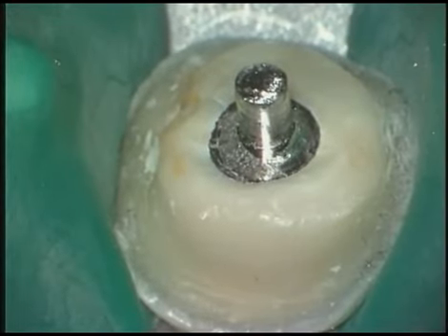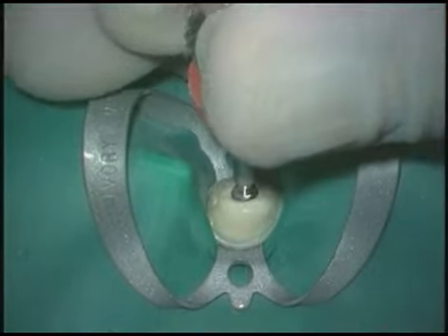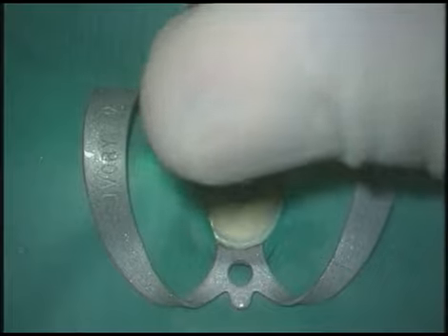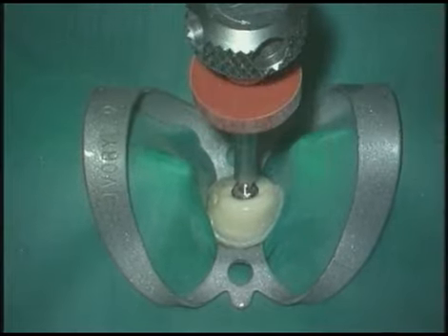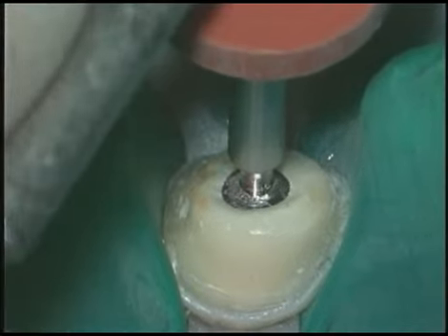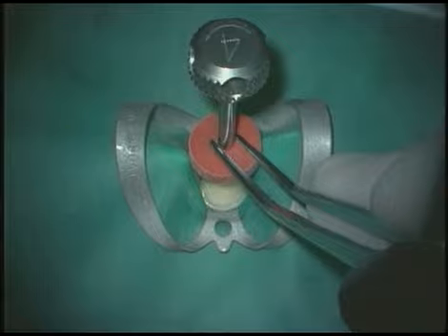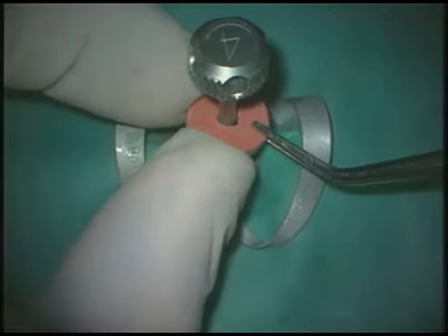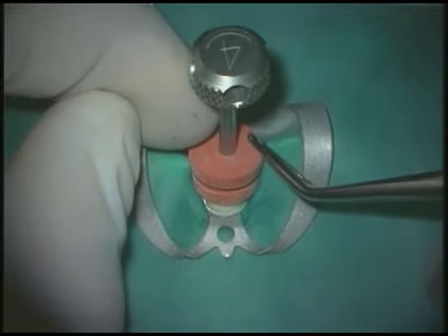Okay, with this exposed, we can now select the tubular tap. It's very easy for this to bite and engage soft gold, and it doesn't take too much rotation on the handle to secure and draw down the tap. We'll go ahead and continue rotating the tap handle until it's secure. As usual, we'll use the protective bumpers.